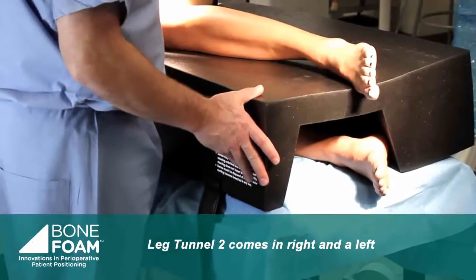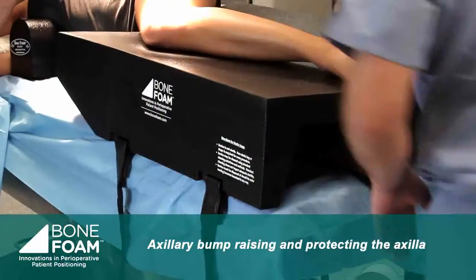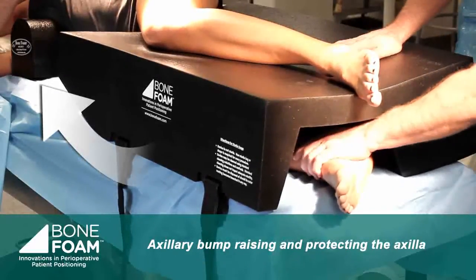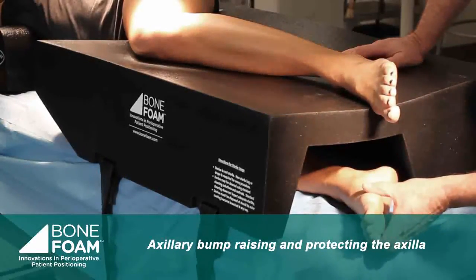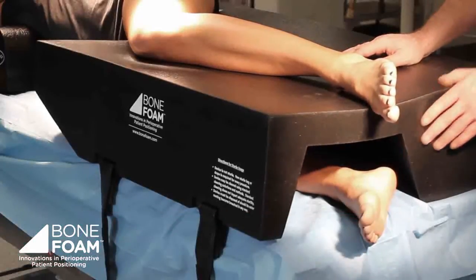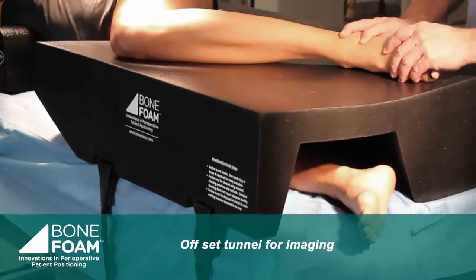Now you can see that the leg tunnel accommodates the down leg, and so the surgeon can check underneath and make sure that, for example, the bony prominences are well padded at the malleolus, and that the peroneal nerve is also either supported or allowed to be suspended, so we don't get problems related to the peroneal nerve. The tunnel is also off to one side, and that allows us to image with the C-arm, for example the calcaneus, like so, in a way that offsets the up leg from the down leg.